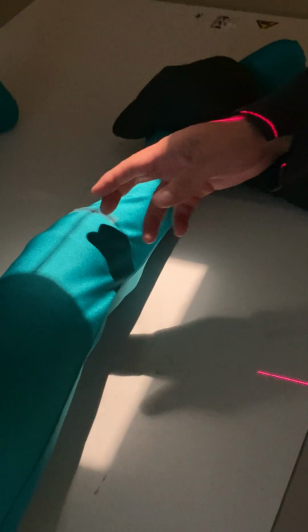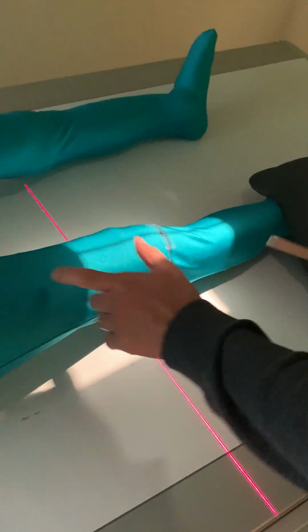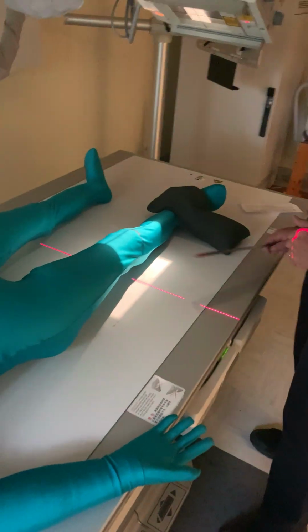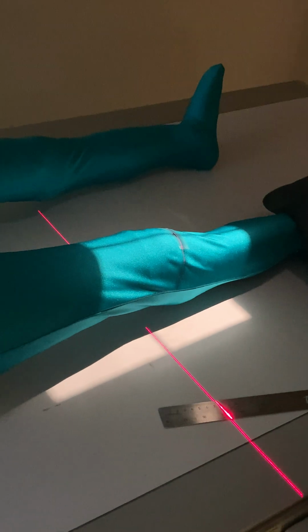and this is from side to side, and from top to bottom I want to make sure that I include the distal 1/3 of the femur and proximal 1/3 of the tibia. If I have that from up and down, then I will have enough coverage.